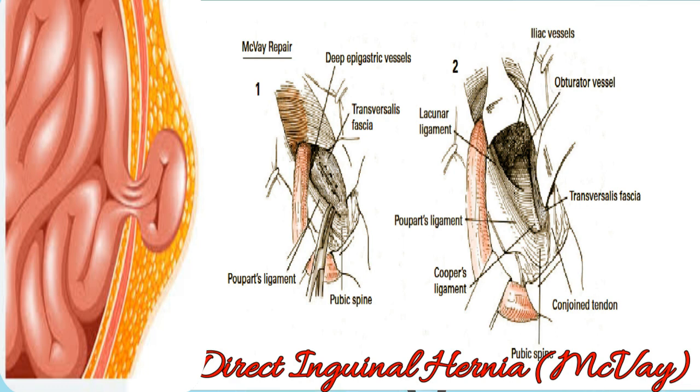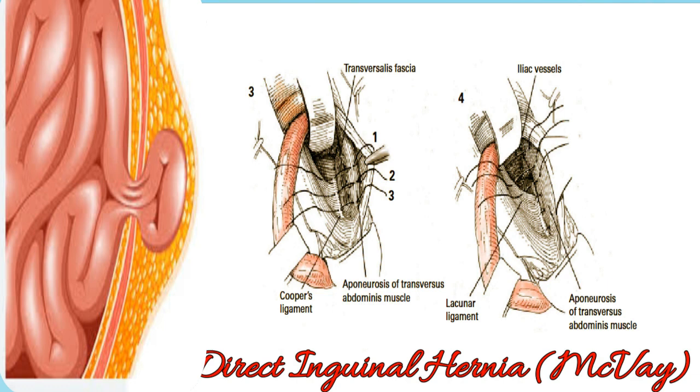As the bulge in this region is retracted upward and medially by an appropriate retractor, Cooper's ligament is clearly visualized as a white fibrous ridge, deep in the wound at the innermost portion of the concavity and closely applied to the horizontal ramus of the pubis. Interrupted silk sutures approximate the aponeurotic margin of the transverse abdominal muscle and the transversalis fascia to Cooper's ligament.